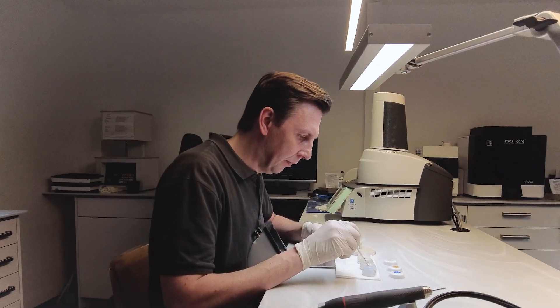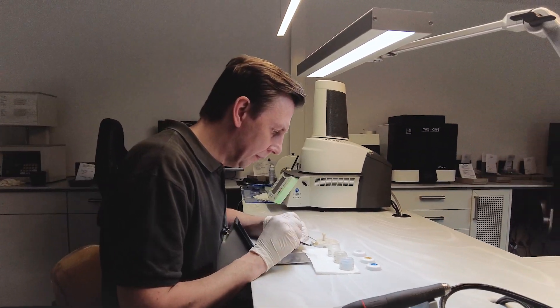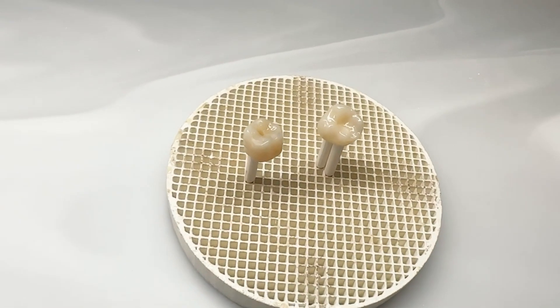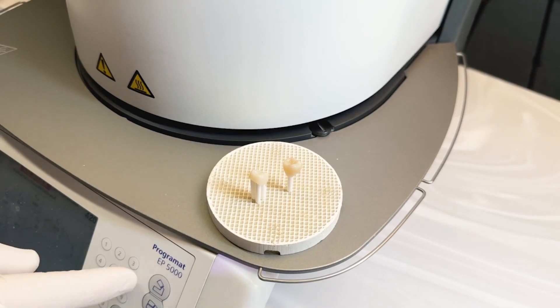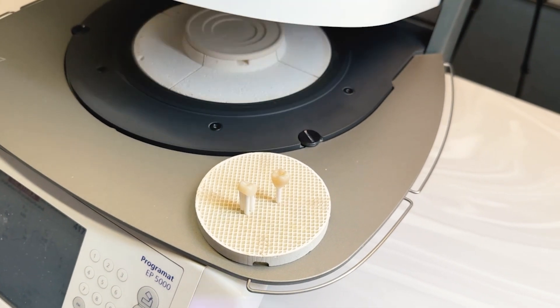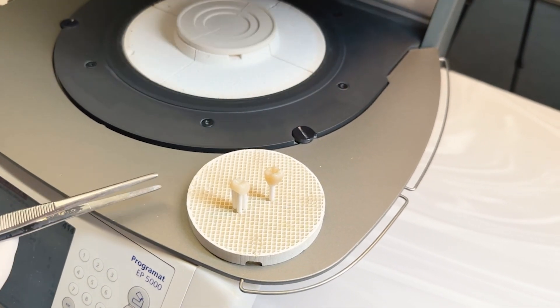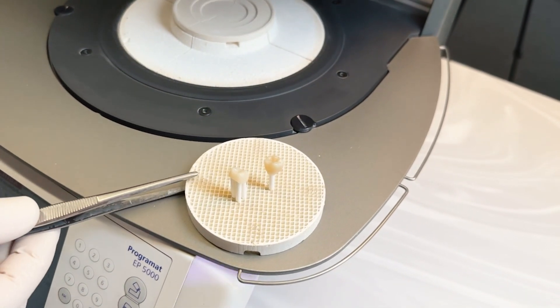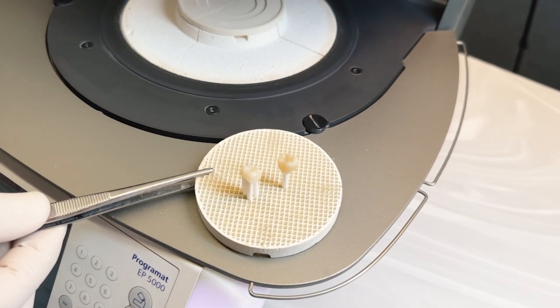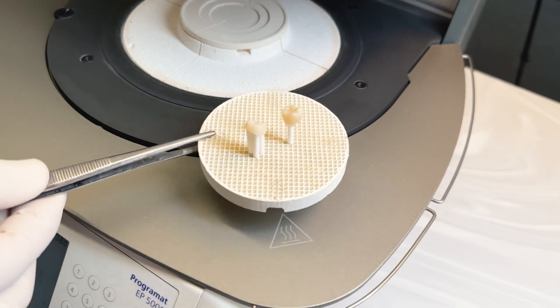To strengthen the restorations and improve their color, they are fired in a ceramic furnace. This ensures that the restorations are high quality and serve the patient well.